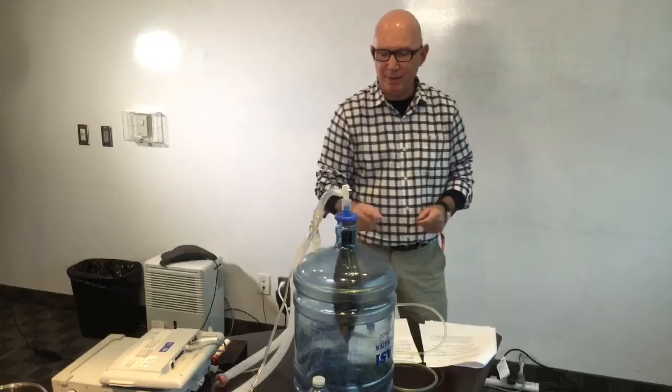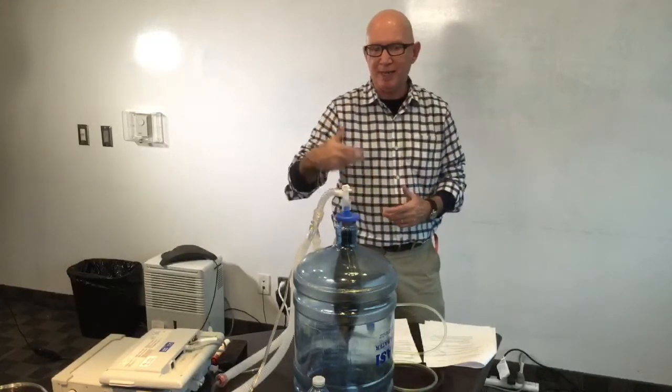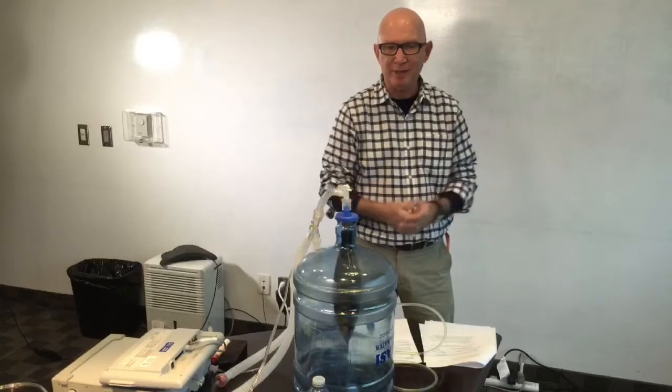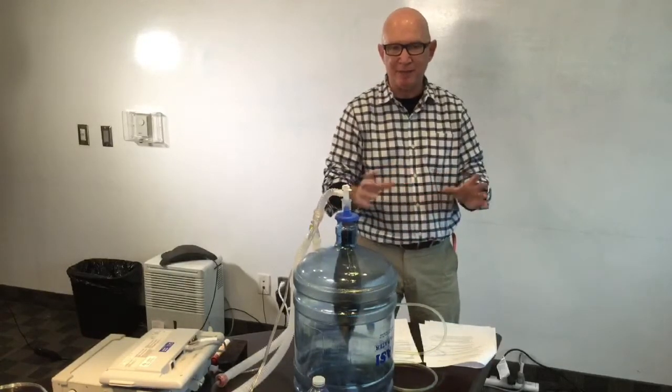And the individual that sent that one in, if it didn't, then feel free to ask something from a different angle that might help me to understand where you're coming from on this. But there are going to be times when we do have to ventilate people with pressures that exceed that, and that's assuming, again, we've optimized everything else.